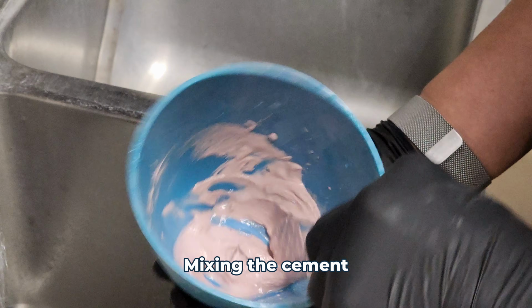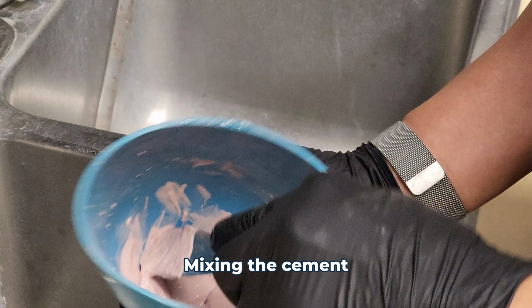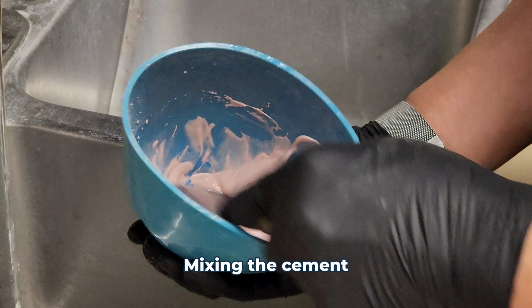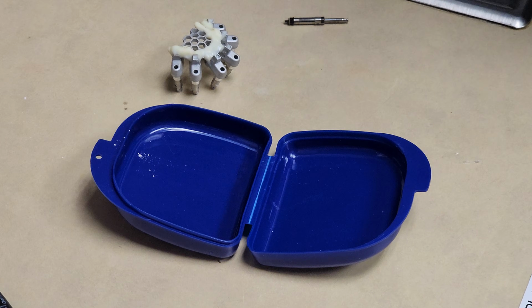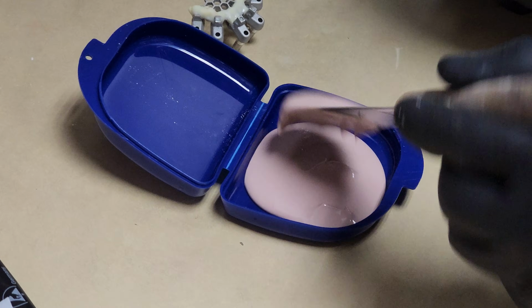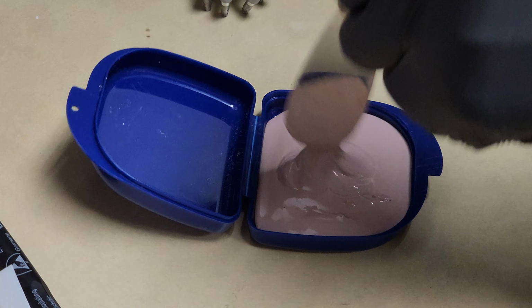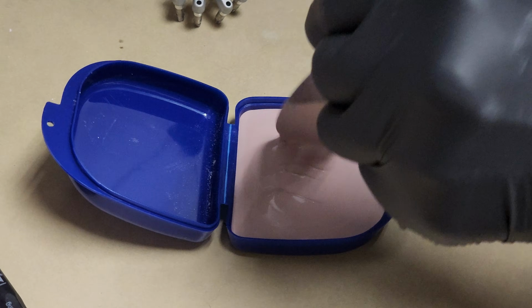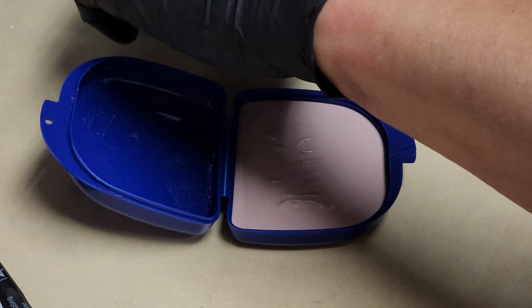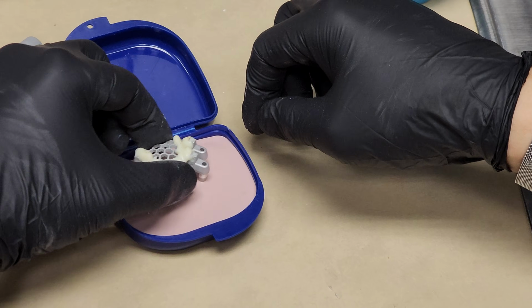So this complex with the analog implants and MU abutments and OptiSplint will set into place over the next 30 to 40 minutes. And then we will have precisely and permanently recreated the orientation of the implants outside of the mouth. From now on, anything we make, we can verify it will insert into the implants perfectly by trying it in first into these analog implants and MU abutments that are set in stone.